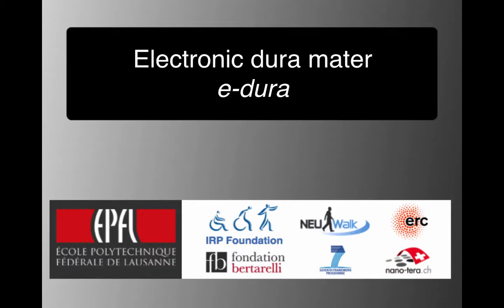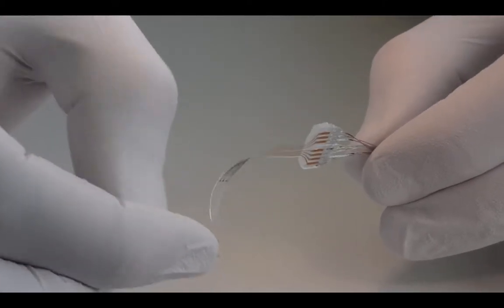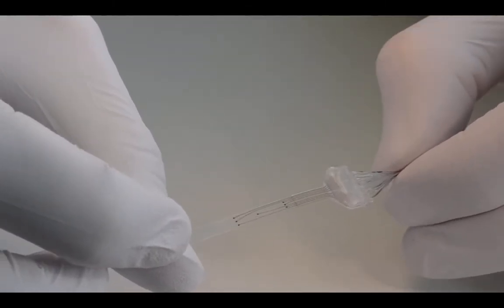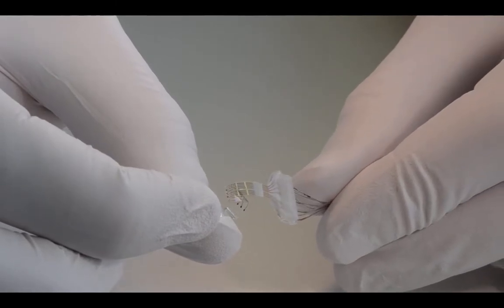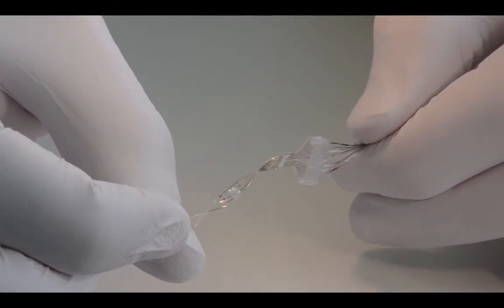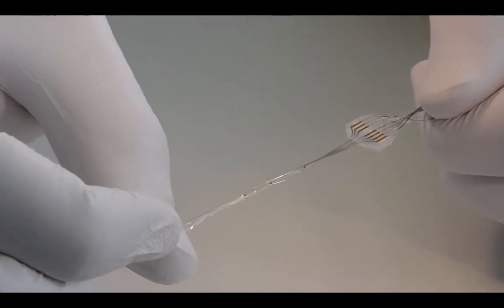Electronic dura mater is a soft, multimodal neural implant designed to mimic the compliance of the natural dura mater, the protective membrane of the central nervous system. This electronic dura mater, which we called eDura, is prepared with silicone elastomer and stretchable microstructured metals. The eDura can be stretched and twisted extensively.